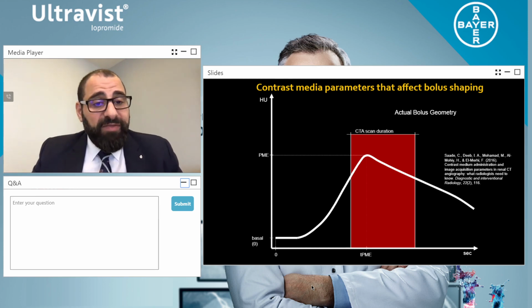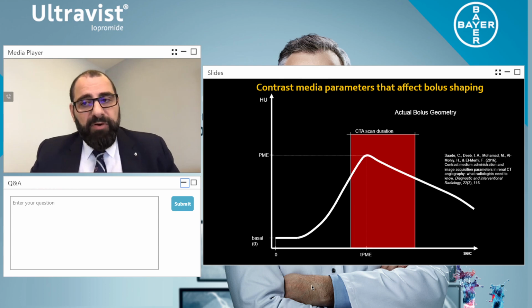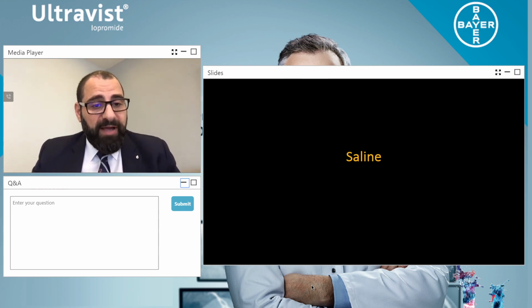So how do we solve this? Saline. Now, saline is important for a few things. One, we've talked about that having saline allows our patient to have a proper hydration status. Now, when we inject saline, 100 mils, which is not a lot, remember, if you drink a bottle of water, that's 350 mils. So 100 mils is 3 times less than what you think. It's not a lot, but people think it's a lot.